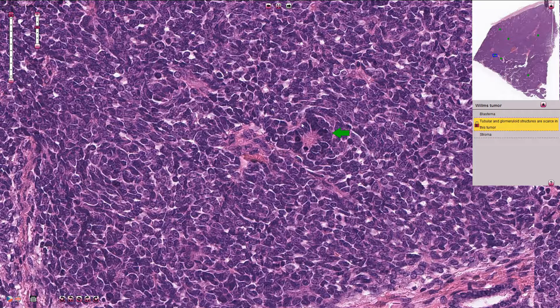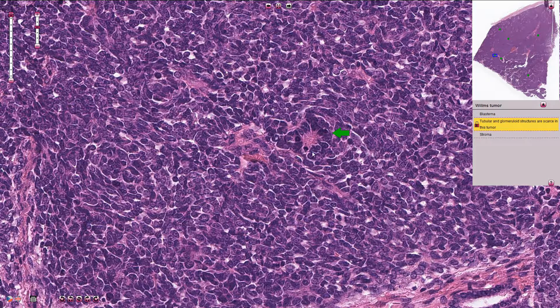Here we have another example — in this case the epithelial component creates these rosette-like structures and tubular structures, but sometimes we can see something that resembles glomeruli.